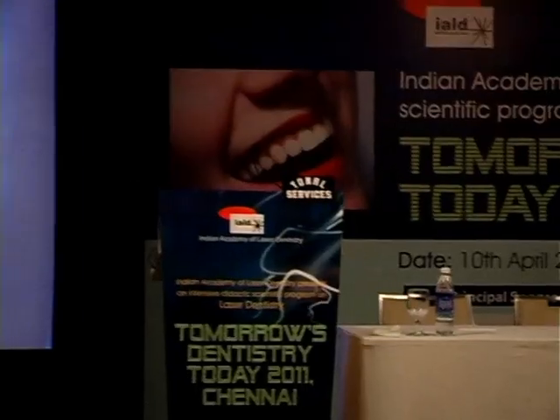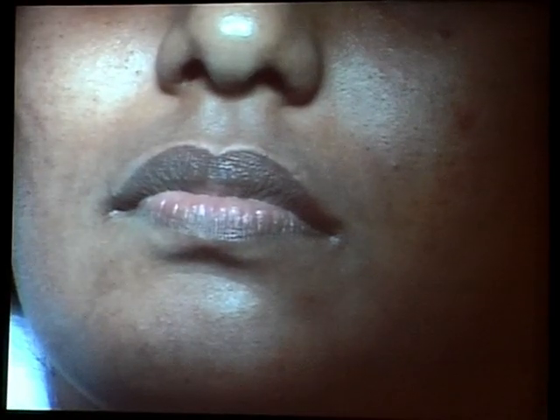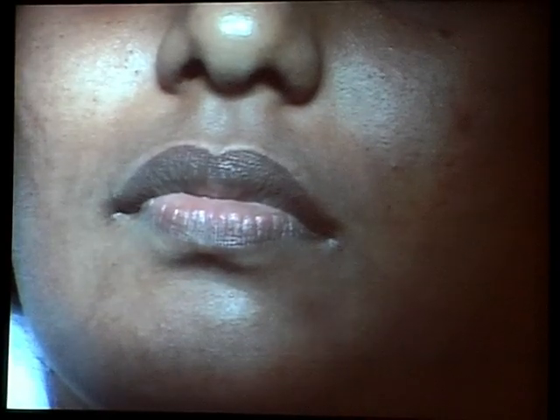Do you think it's too much for Indian skin? Again, vision is better, so you can see down much better than you could with a scaler. The problem with scalers is that there is a lot of bleeding because the tissues are very inflamed and therefore they'll bleed. But here there is automatically a coagulative effect. Because you always have to keep in mind if there is a shot given to the gingiva, it's getting more pale, so the absorption is getting poorer.